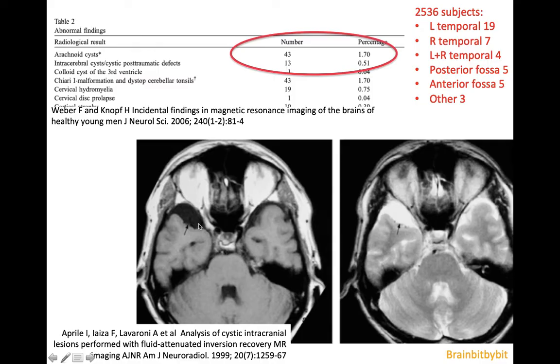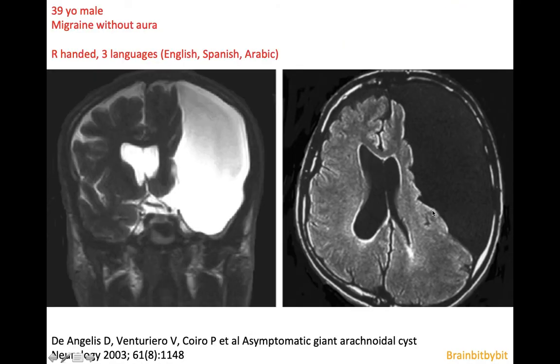Arachnoid cysts are extra-axial cysts filled with CSF, so they have low signal on T1, high signal on T2, and exactly the same signal intensity as CSF on FLAIR images. These T2 and FLAIR images are from a male patient with a very large arachnoid cyst interpreted as asymptomatic, because despite compression of the left hemisphere the patient had no language difficulties — he even spoke three languages.